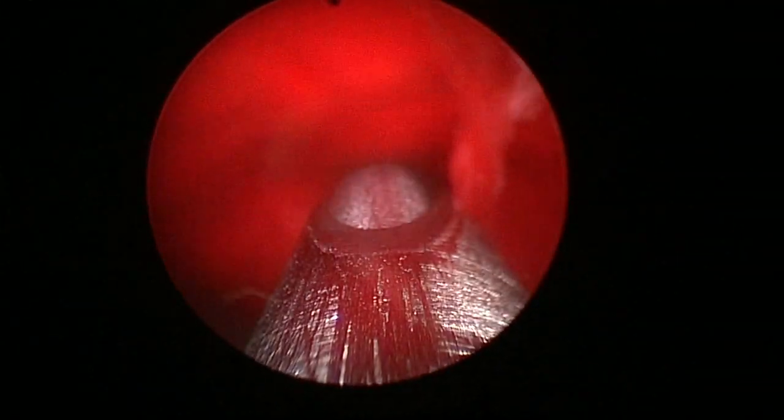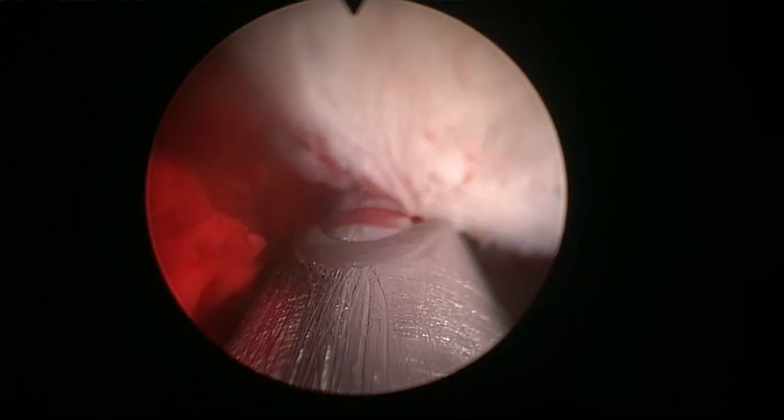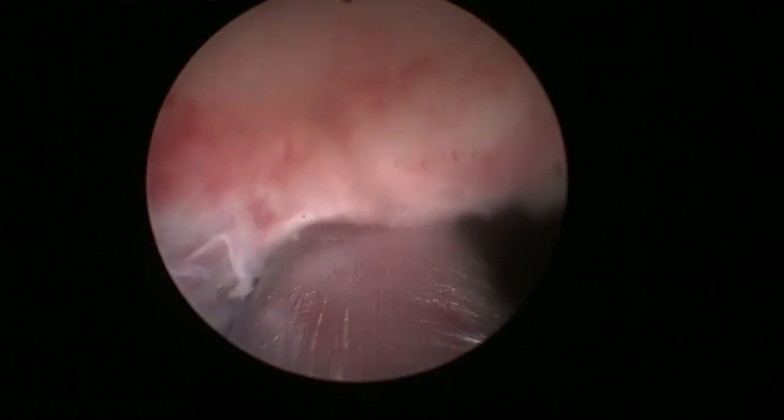Okay, water in, please. That's a clot. See, there's a clot. Open, open. Open both of them when you can. It's just a clot. We are under the clot, so you can suck the clot. That's tissue. So let's start the morcellation again.